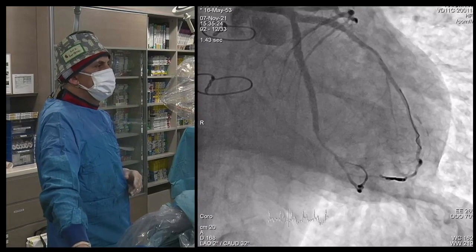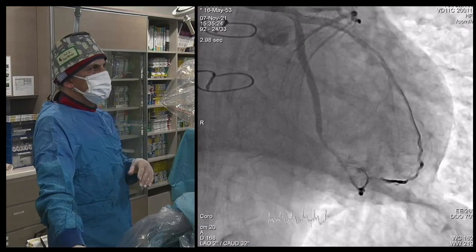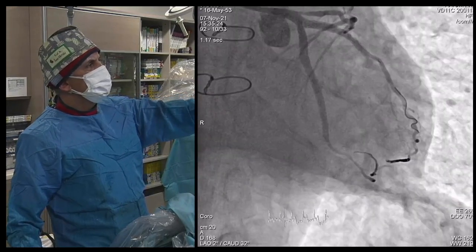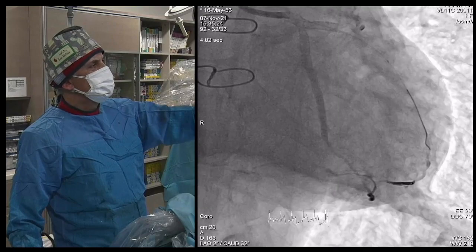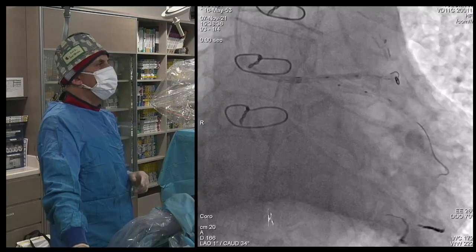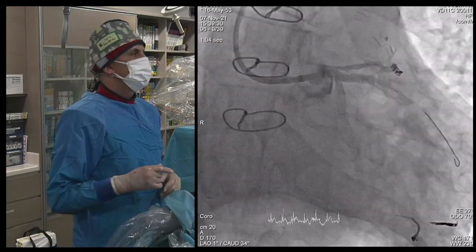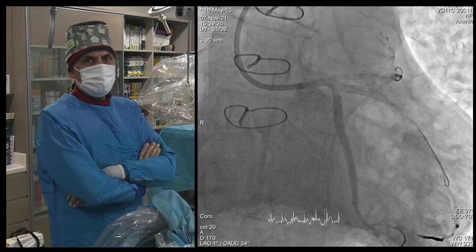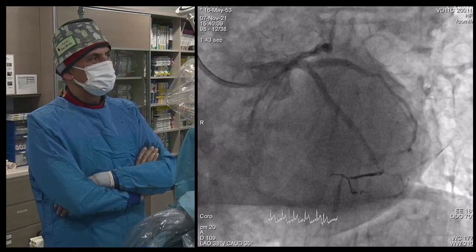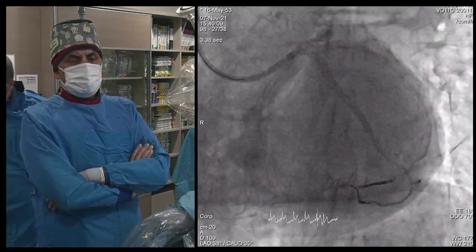We checked after several minutes and are very happy — it's almost completely occluded and will fully occlude. At the left main, we confirmed a plaque shift toward the LAD. The LAD is a good vessel with septals going to the RCA. We did kissing here to open the LAD ostium with a 2.5 balloon. Congratulations — really a very tough case. This is the final result. What is important is to cope with complications — that is the main principle of doing interventions. Thank you.